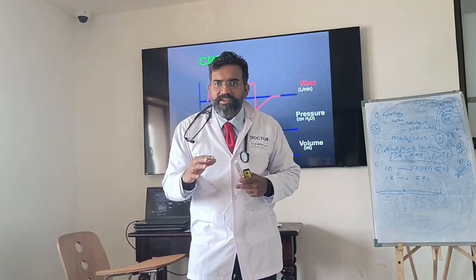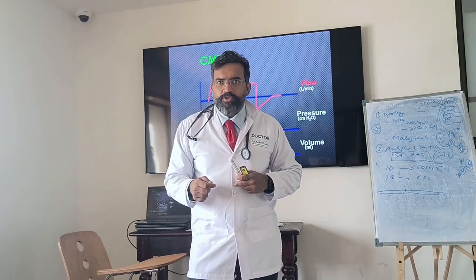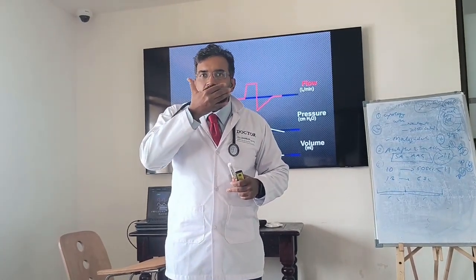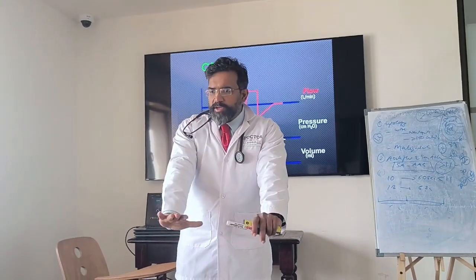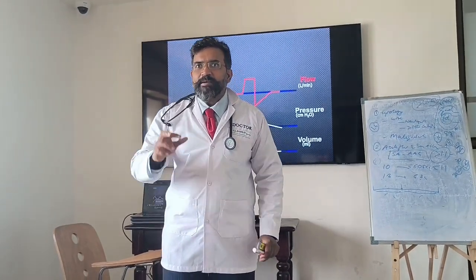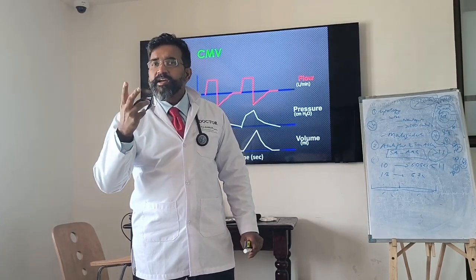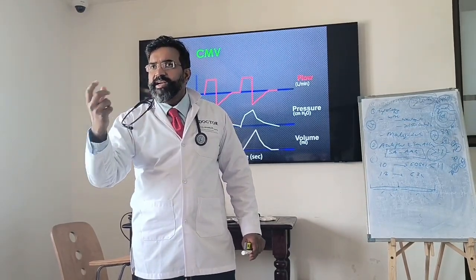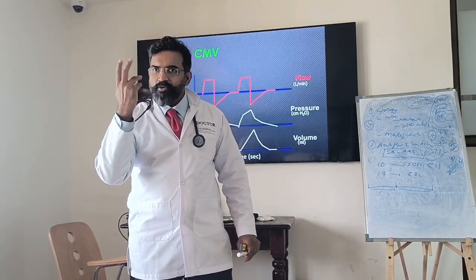Now if I make it a machine trigger, the patient is trying to take a breath but the ventilator is not giving a breath. It is like choking. I'm not getting a breath. If I put a pillow on your face, you can't breathe. You're trying to breathe, you can't. That becomes ineffective for the patient. It causes asynchrony. Asynchrony means the patient is fighting the ventilator. It is not coordinating with the ventilator. It is not synchronous. You understand?